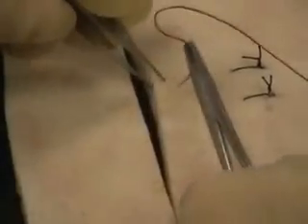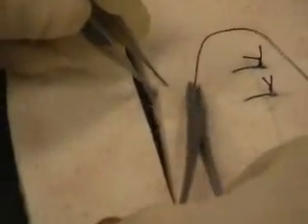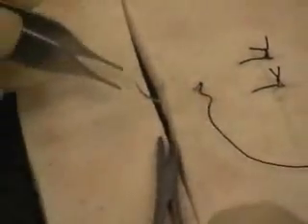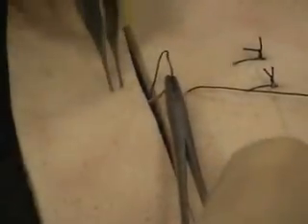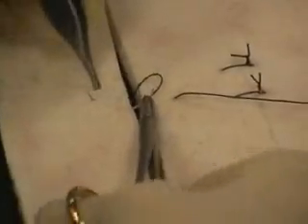And so what we're going to do is a little bit further away from the wound edge. We're going very, very deep, as low as we can, but not underneath. Definitely have to reload halfway through on this one, because if you try to take it all in one bite, it's way too big. And we're going to come out again quite a bit further from the wound edge. Okay, now this is where it changes.